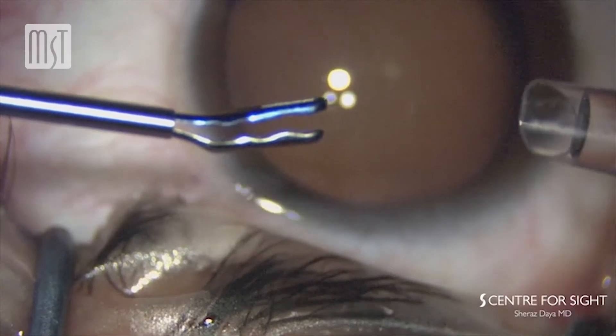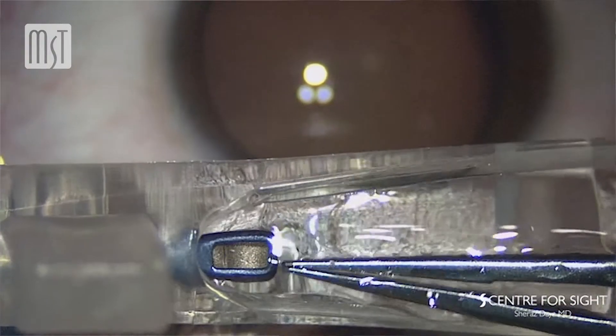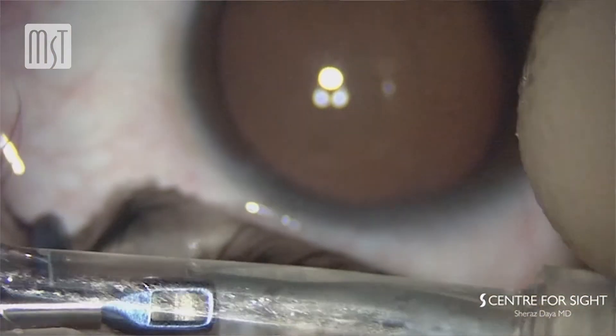One of the problems is visualization. That's why I asked them to create a window in the device and solve the problem of scratching the side of the cartridge, to round off the edges as well as the front. So now it's got a bullnose and it's rounded off beautifully. With this new grasper, I can see exactly what I'm doing. I'm not scratching the sides. I know exactly how much of the lens I'm grasping and where I'm grasping it — usually in the middle of the two foot plates. I can pull it into the cartridge knowing that it's upright, so when I inject the lens into the eye, I don't have to worry about it being upside down. It solves all those problems and it's been wonderful to use.